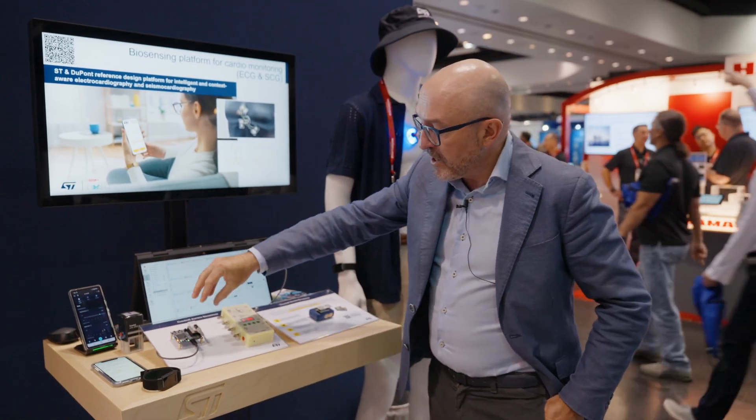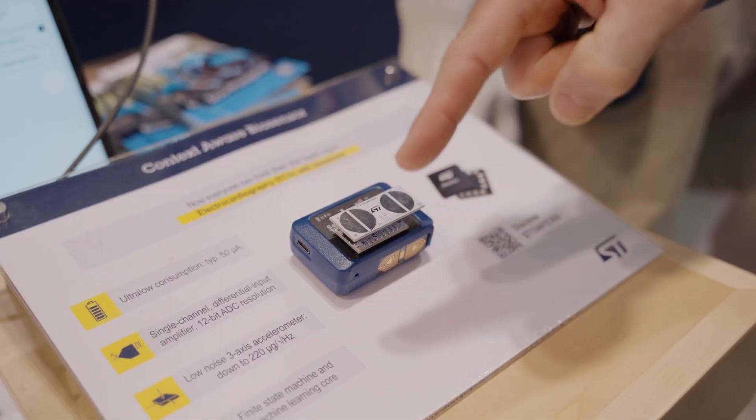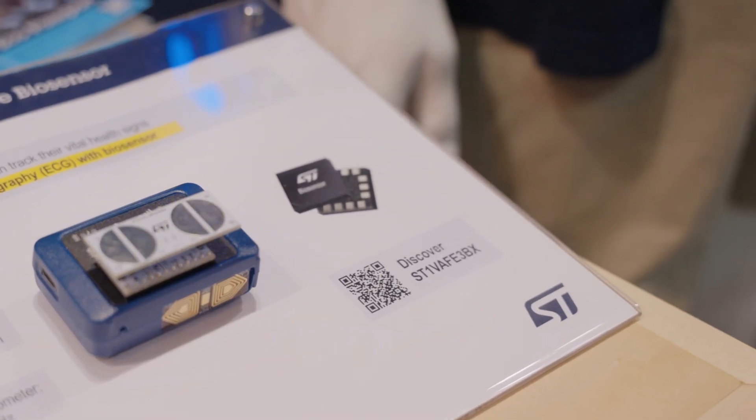We have a version based on ProfiMEMS, and we have a version based on another eval kit called SensorTile.box PRO. The sensor I'm talking about is called ST1VAFE3BX.